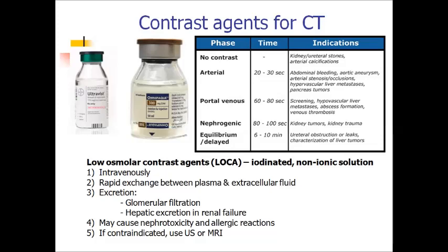After injection, a CT study with contrast divides into several phases. First is without contrast, then the arterial phase, about 20 or 30 seconds, when large arterial vessels are contrasted, enhanced.